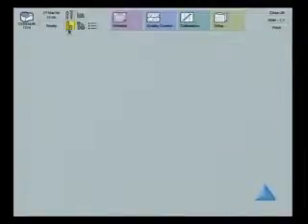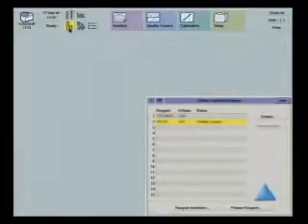At the workspace, select the Reagent Status button, and the Status Ancillary Reagent window opens if an ancillary reagent requires attention. The Status Ancillary window displays the 15 positions in the ancillary compartment, the ancillary reagent, the volume available, and any status messages. Some of the yellow status messages include Depleted, Lot Expired, and Stability Expired.